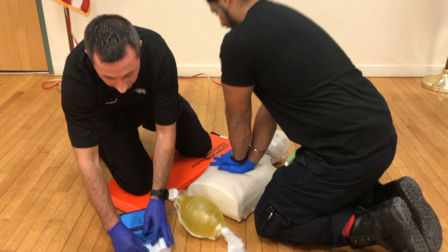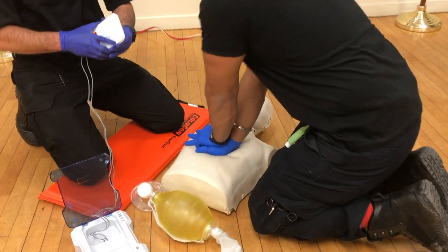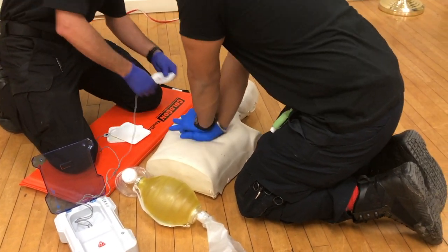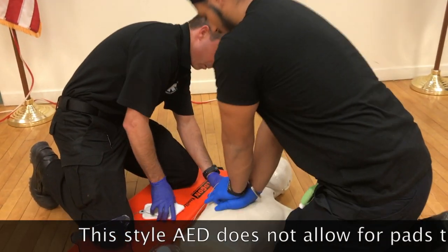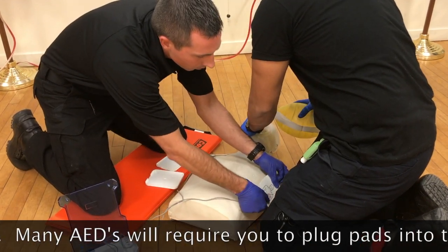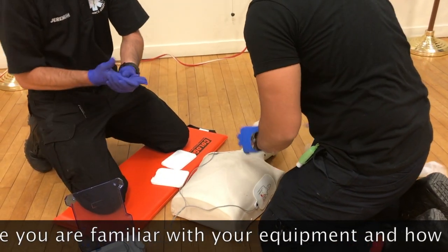First thing I'm going to do is turn on my AED. Remove clothing from the patient's chest. Then I'm going to apply the pads — open packet and apply pads onto patient's bare skin. Press pads firmly on skin. Apply pads as shown. Pads are on. We make sure it's plugged in.